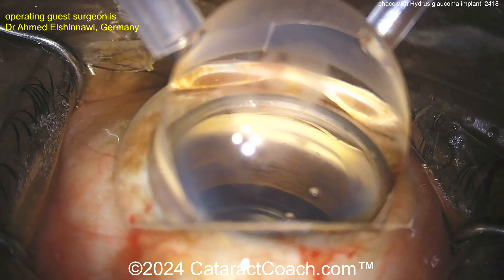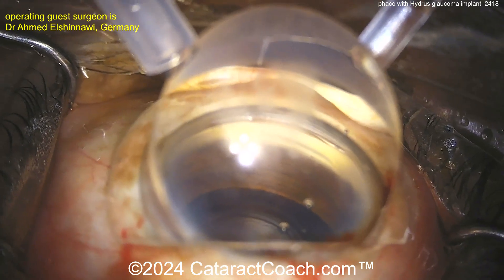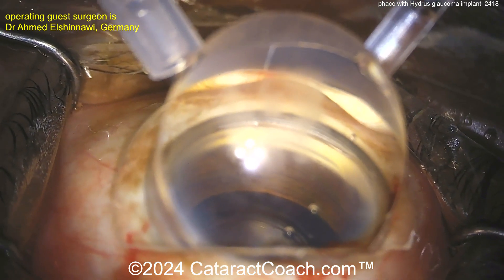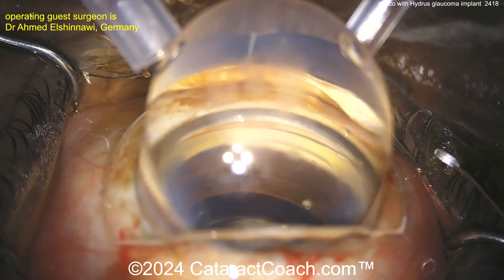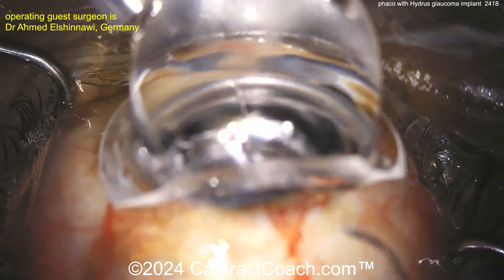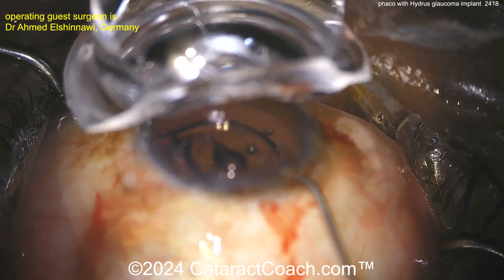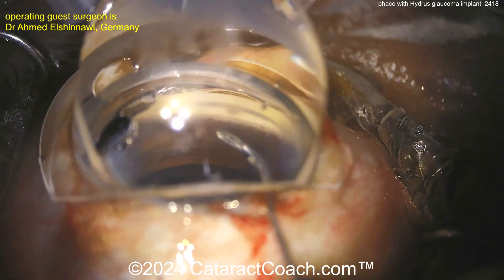Look at the angle anatomy — it looks great. Importantly, notice there's no blood in the interface of the gonio prism on top of the cornea. If you have an incision that barely nicks limbal vessels, make sure you wash off all the blood so you have a nice pristine view like this. Now putting the Hydrus device inside the eye — get those bubbles out.